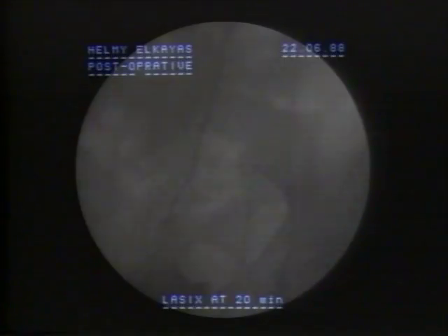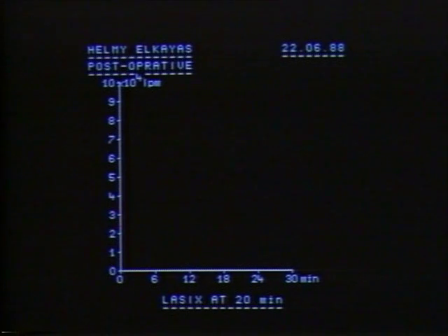The antegrade study demonstrates free passage of dye from the kidney down the tailored ileum to the urinary bladder. It can be observed that the tailored ileum has a lumen similar to a normal ureter and exhibits active peristalsis that results in a unidirectional flow of urine. Similarly, a diuretic renogram illustrates a positive response to intravenous Lasix. In this fashion, the ureter has been replaced by a segment of small intestine with optimized physiological and urodynamic properties.